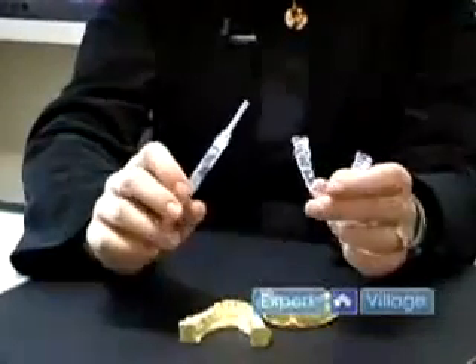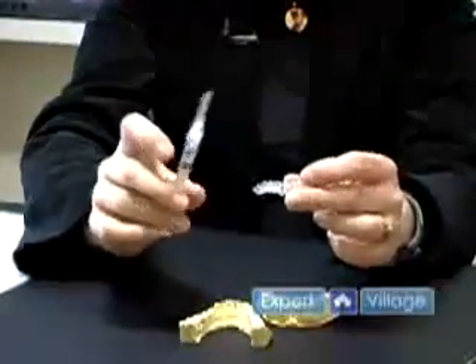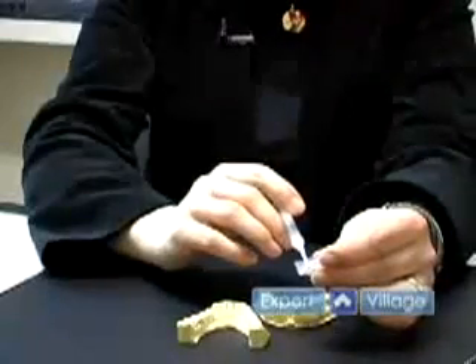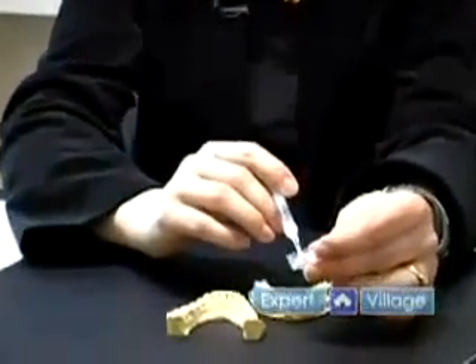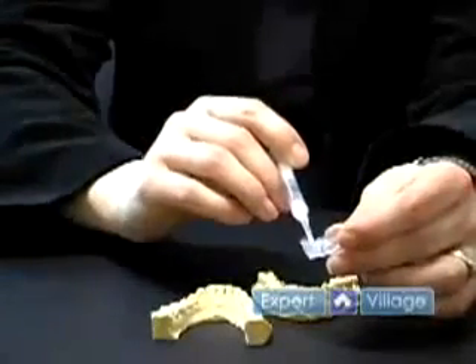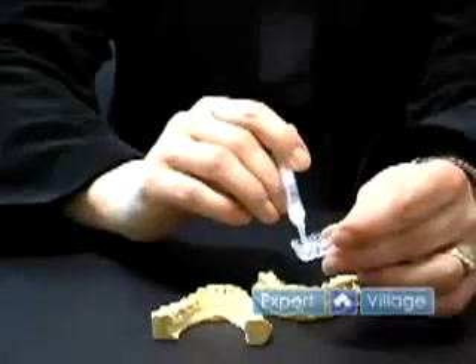The first thing you would do is brush and floss your teeth and make sure you're applying it onto clean teeth surfaces. You take your tray and apply the bleach on the internal surface of the tray, on the front parts of the teeth, whatever teeth you and your dentist have decided are good candidates for bleaching.